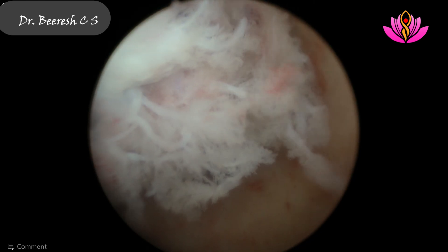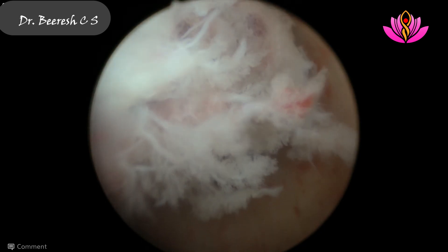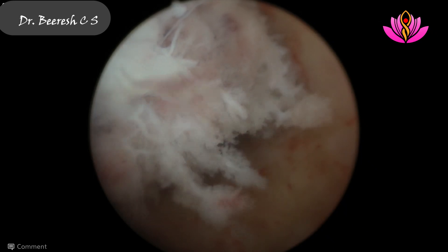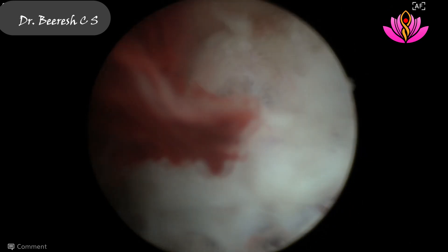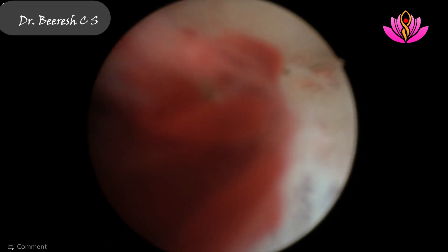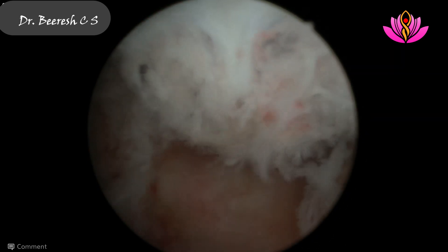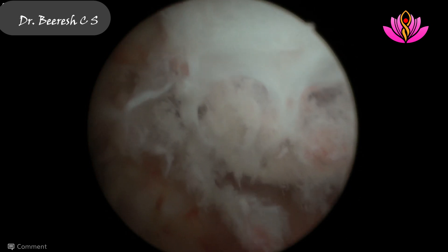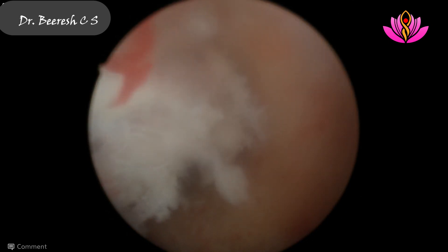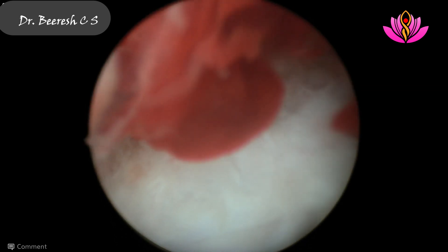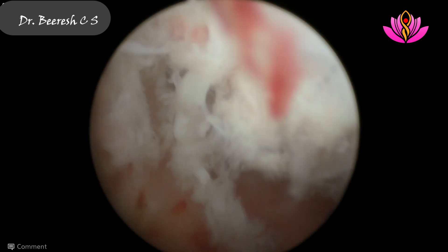That is the 360-degree view of the trophoblastic tissue and the disturbed scar ectopic pregnancy, where you can visualize the villi as well. This was probably a little bit advanced caesarean scar endophytic type of pregnancy. The patient gives a history of amenorrhea of roughly around two and a half months, following which she had bleeding and a blind dilatation and evacuation was done. She then persisted to have vaginal bleeding and presented to us. On evaluation, a hypoechoic mass in the isthmocel region with vascularity was found, and the urine pregnancy test was positive.